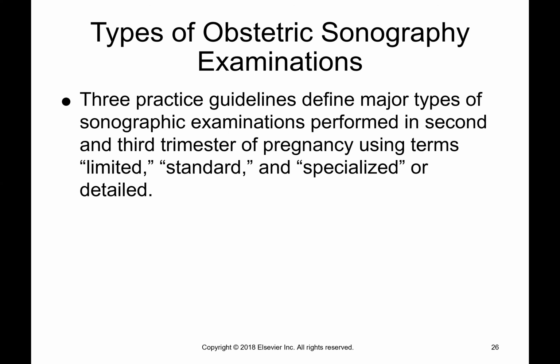Or there's a specialized scan. And I also do these where I work because I work for maternal fetal medicine. So if something is off on the standard scan or they suspect some kind of anomaly, they will send a patient to a maternal fetal medicine doctor who specializes in these kinds of things, and we'll do a specialized scan, which is more of a detailed scan of the baby.